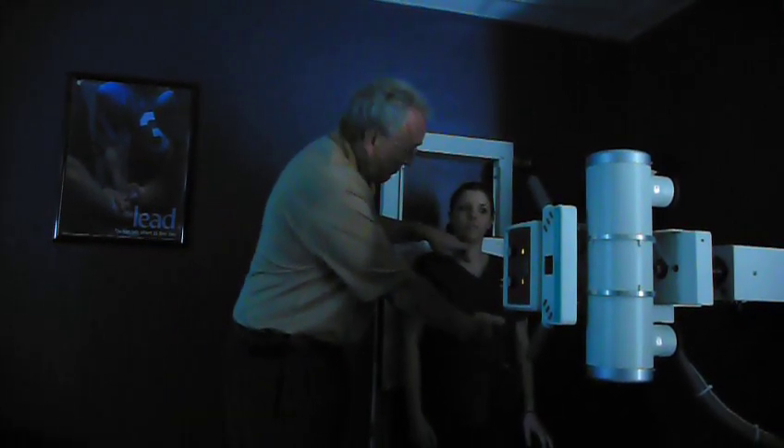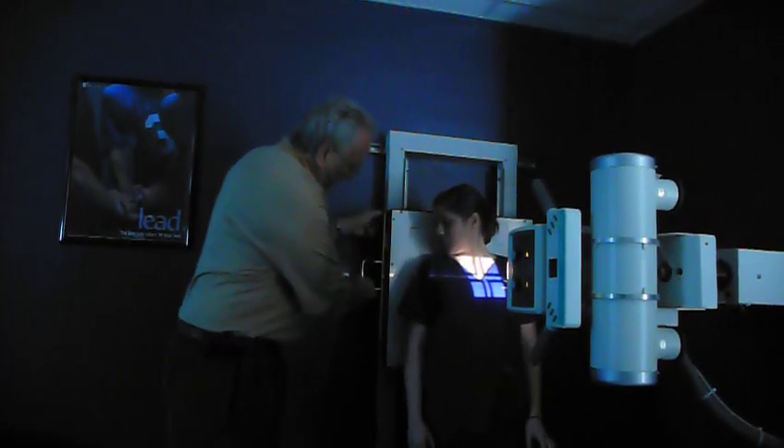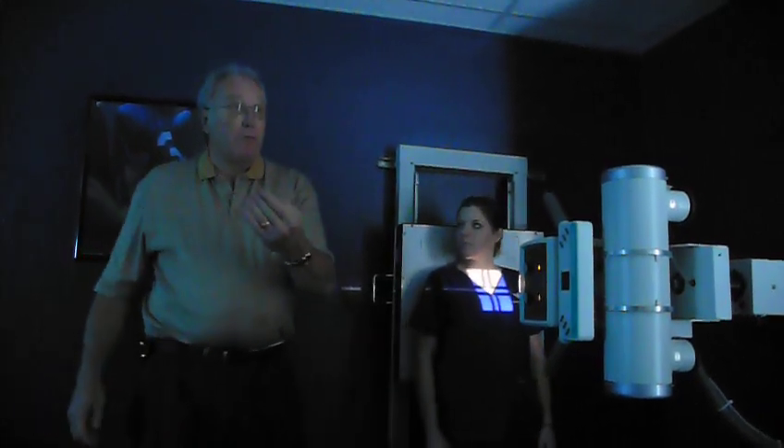I'm right mid-sternum. If I go like this and find her xiphoid tip up here, I'm halfway between both. I have her set up, I don't need to touch anything, I got my 10 by 12 film in.